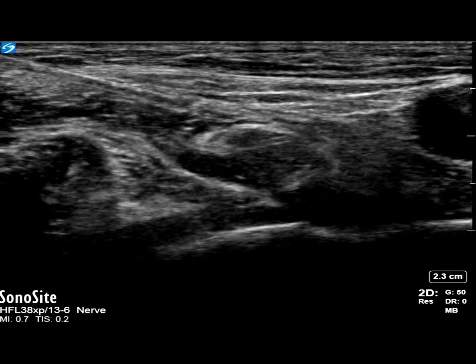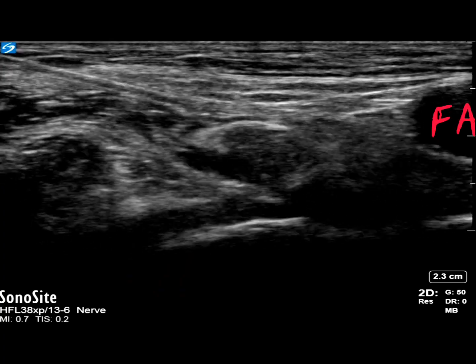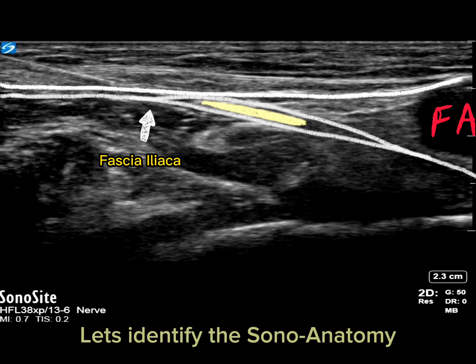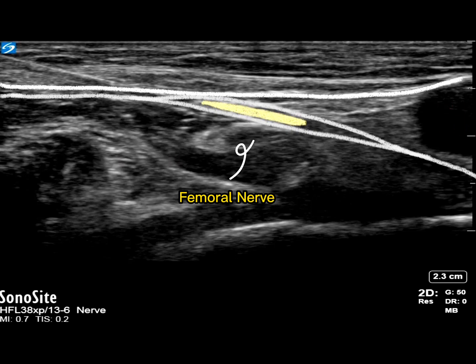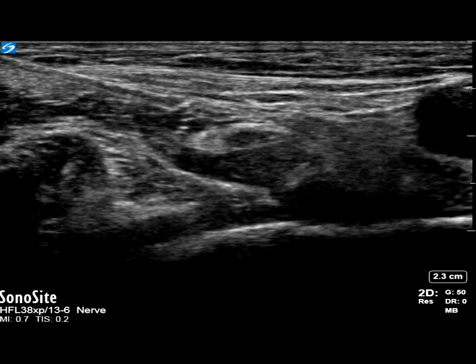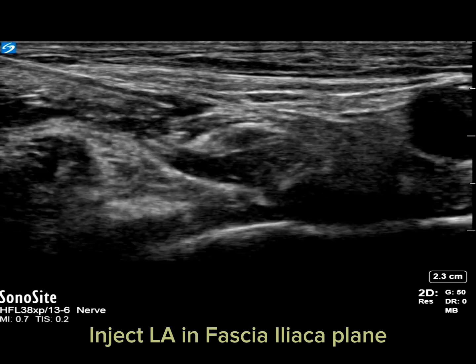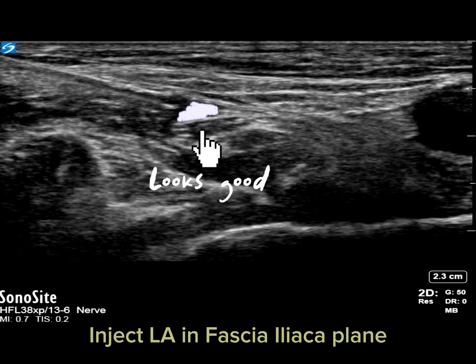Let's identify the relevant sonoanatomy. Identify the femoral artery and the fascia iliaca, which encloses the femoral nerve, as shown. We inject a small amount of local anesthetic to identify the spread.